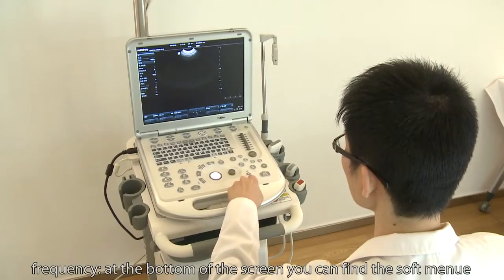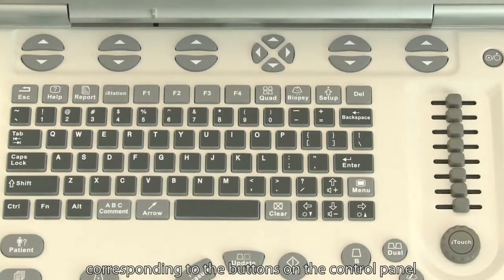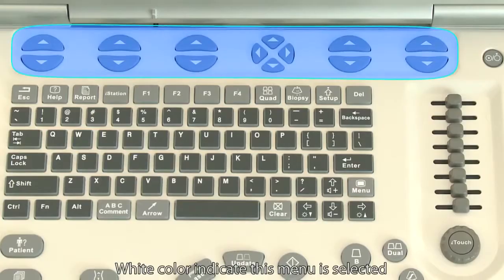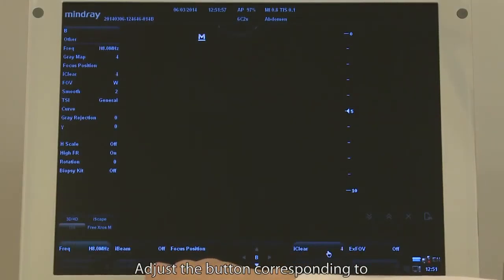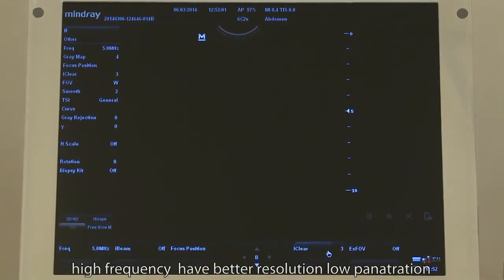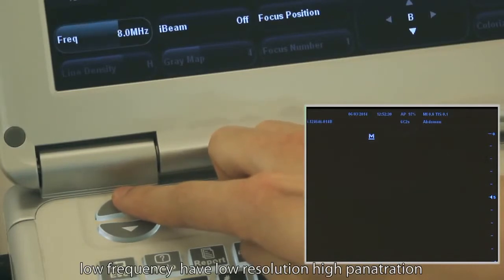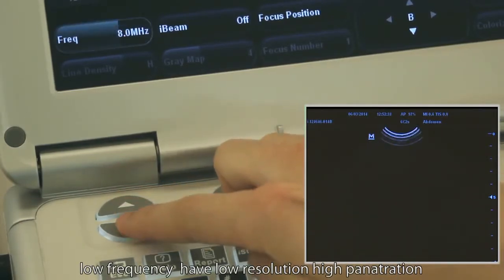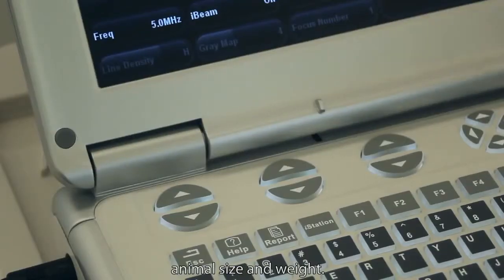At the bottom of the screen, you will find the frequency setting. Adjust the button corresponding to frequency to select the right value. High frequency gives better resolution but low penetration, while low frequency gives lower resolution but higher penetration. Choose the right frequency according to animal size and weight.